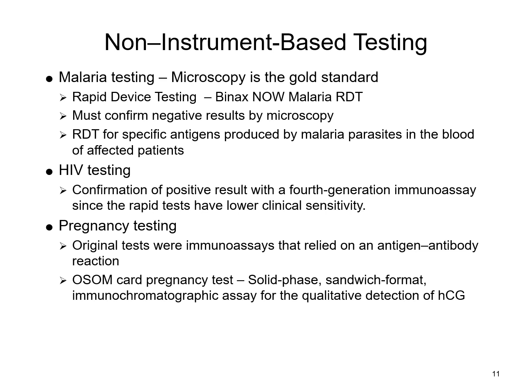So malaria testing, of course, the gold standard is still to visualize that organism under the microscope. But there have been some rapid detection tests developed over the years that will detect the presence of malaria within that specimen.